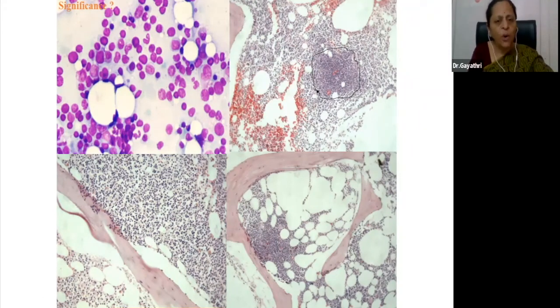We know that for all lymphoid proliferations, establishing clonality is vital. So to establish clonality, marrow cytology alone is not sufficient. Peripheral blood can help you establish clonality by doing a flow cytometry. If you do a trephine section, you will establish clonality and also get a chance to look at the distribution of these lymphoid cells.